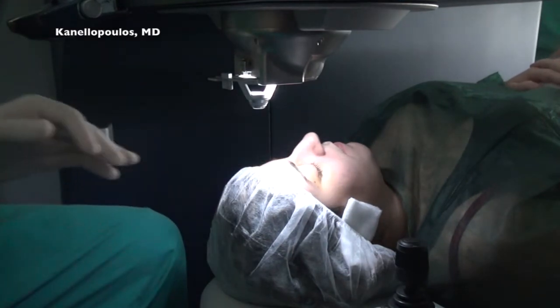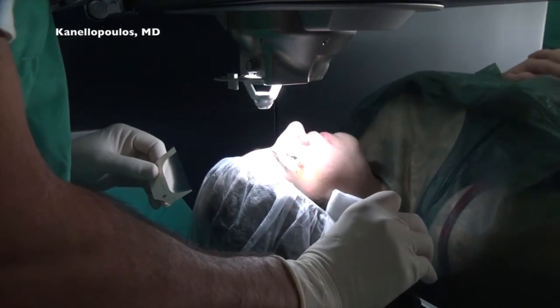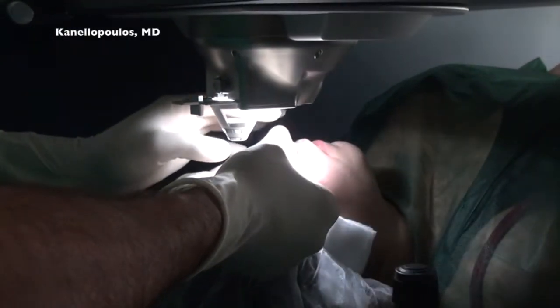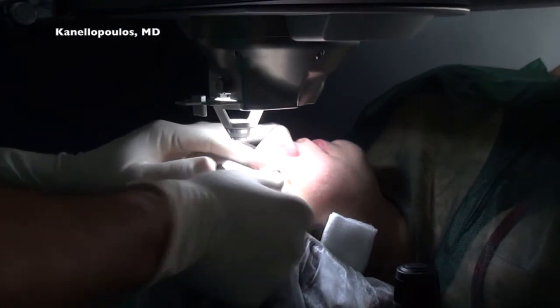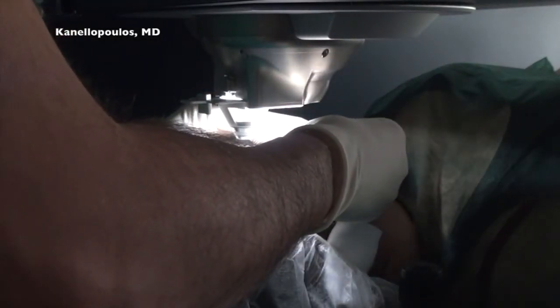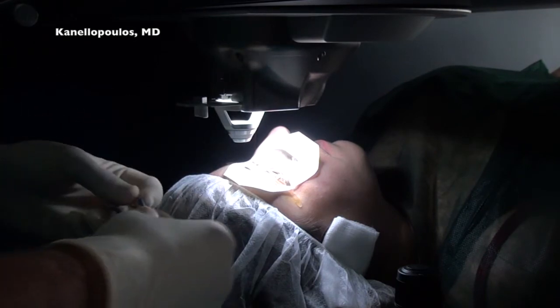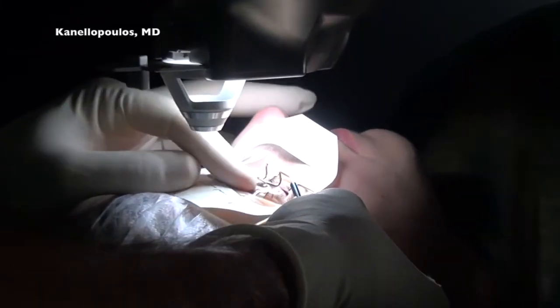We will use a Tegaderm as a patch on the left eye. We'll use half of it to draw the upper eyelashes and then another half for the lower eyelashes in a way to drape the lashes away. We've prepped the eyes with a betadine swab stick before to rub the eyelashes and leave some of the betadine solution in the cul-de-sac, and of course after a drop of moxifloxacin. And here's the aspirating speculum. We will not use aspiration during the femtosecond laser flap creation.